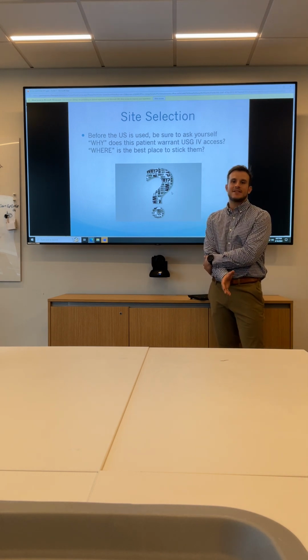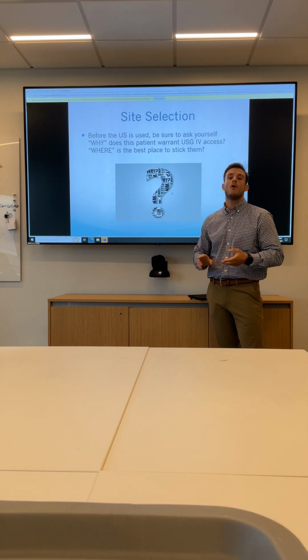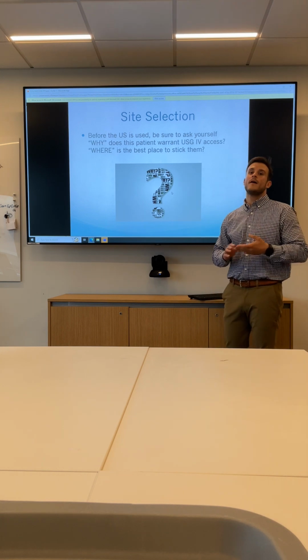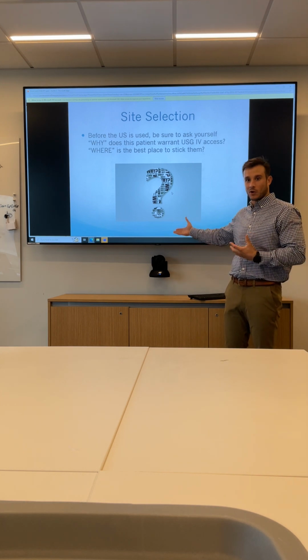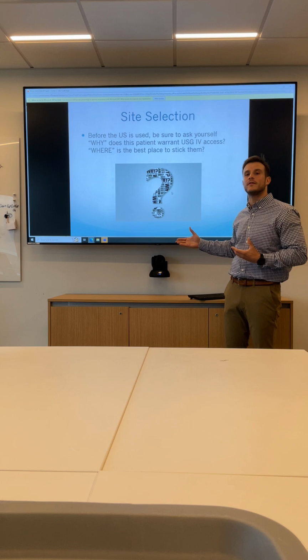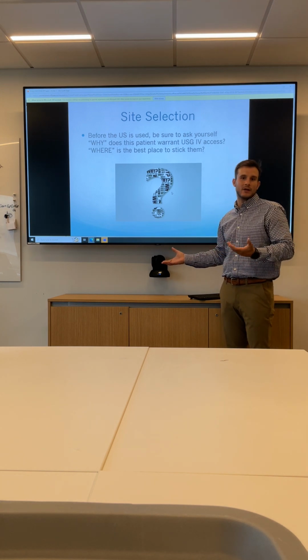Look at the patient, assess them, go up to their arms, their hands. Are they edematous? What's in their history? Are they a difficult stick? Do they have renal dysfunction? All of the things that we cited on the patient populations that require ultrasound-guided IVs, these are important things to look up before you walk into a patient's room or while you're getting a report on your patient.